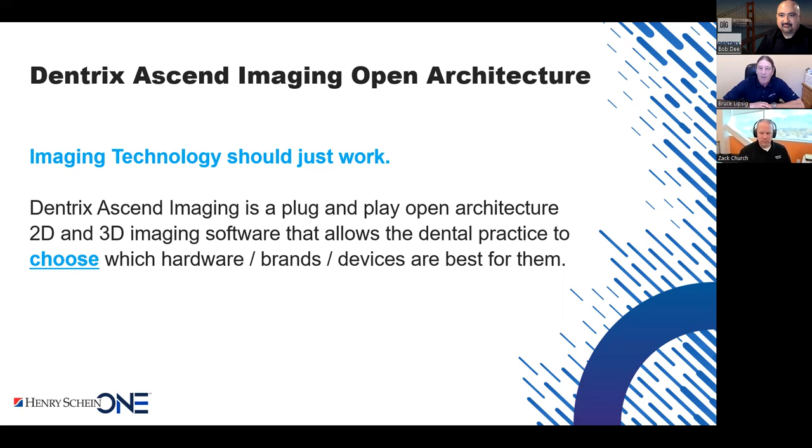How would that feel? I mean, the ability to go ahead and try all these different devices and bring them all into your one application so that you can compare them side by side, use them side by side as you need. And Dr. Bob, you're telling the real world story of the technical story that I just told, and I appreciate that. Thank you very much. That is one of the most important things moving forward. The hardware has grown up now. Imaging has grown up now. You don't need to be forced into using the hardware and the imaging that come together.